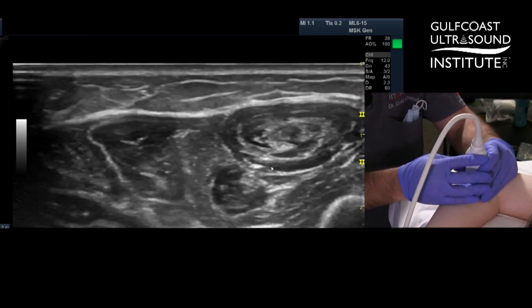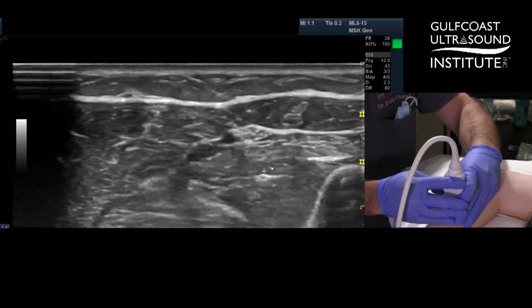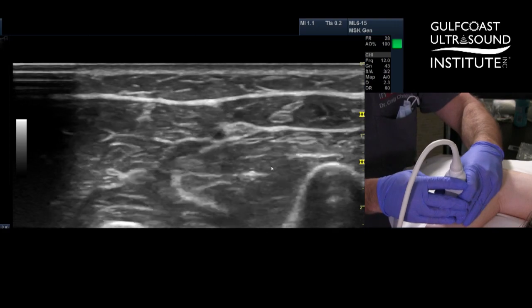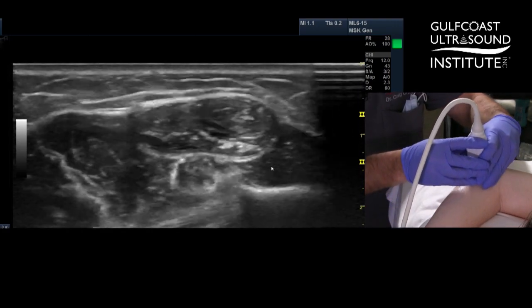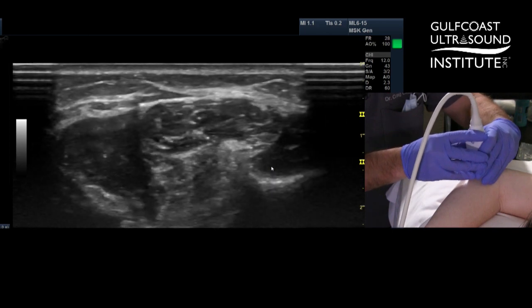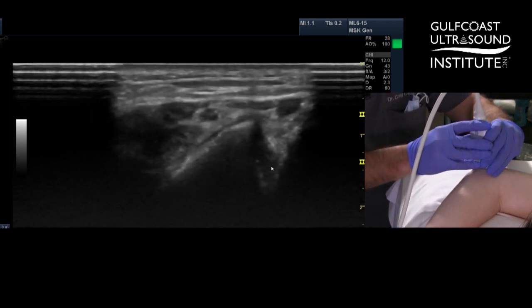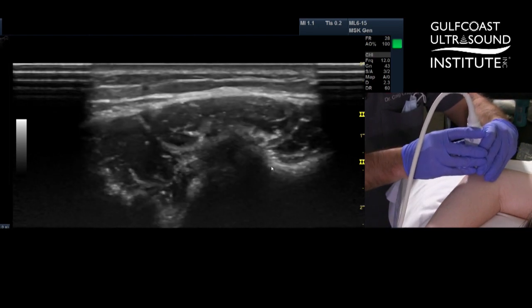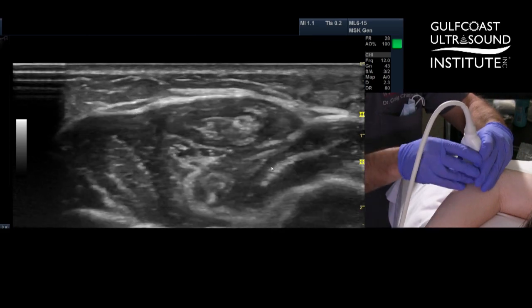And now we're going to scan it. So we got fluid all the way down to the mid forearm. We come up, we got it surrounding it all the way back up into the cubital tunnel there. And around, and it doesn't get up that high. So it gets right basically as the flexor carpi ulnaris hooks onto the medial epicondyle and olecranon.